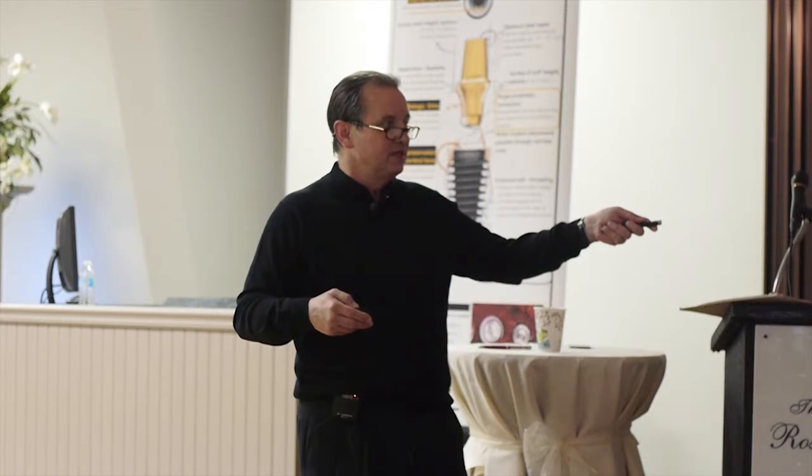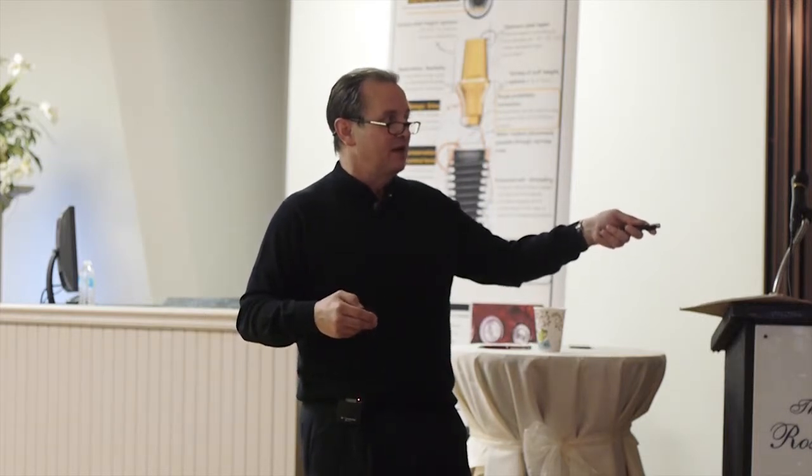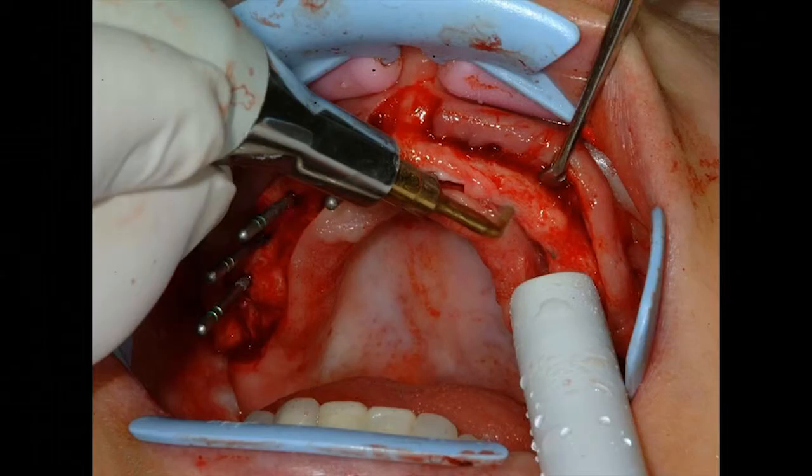So he smokes. He's got poor oral hygiene. So we're going to go ahead and do some implants. So this tooth's abscessed. These two are touching each other. There's vertical loss here. These things are sticking way out. I mean, it's just a mess.